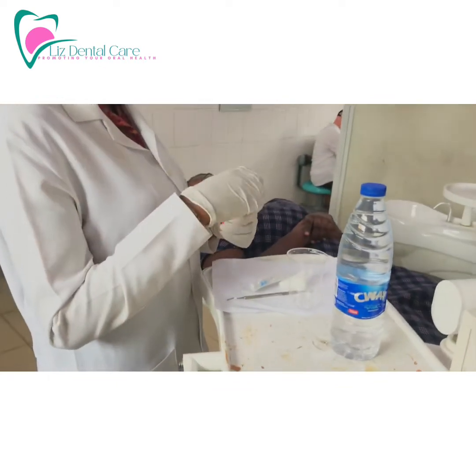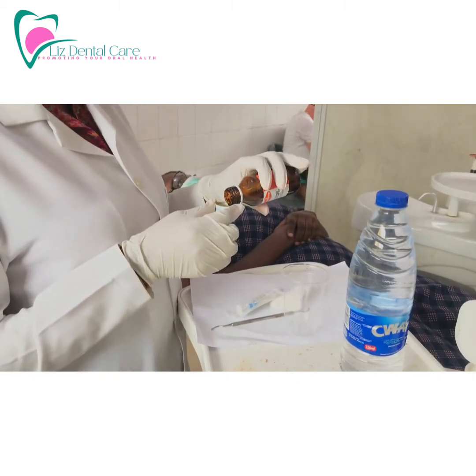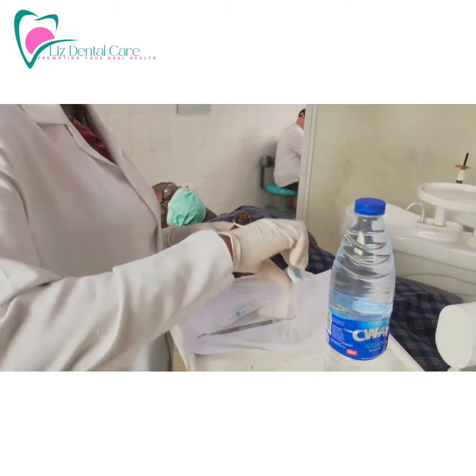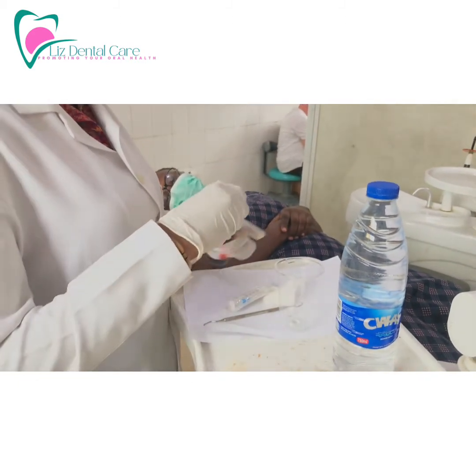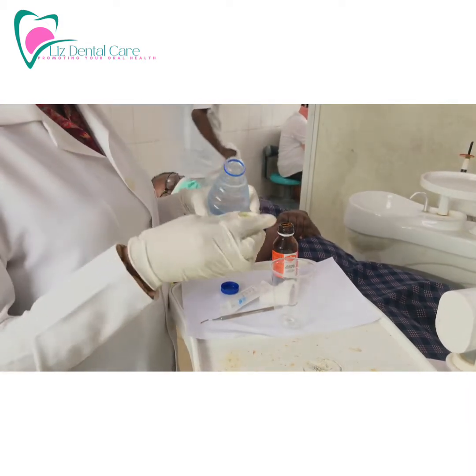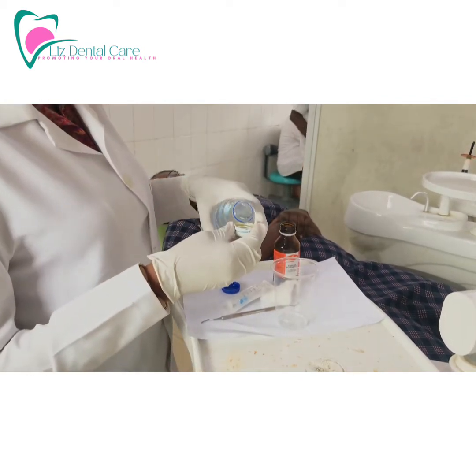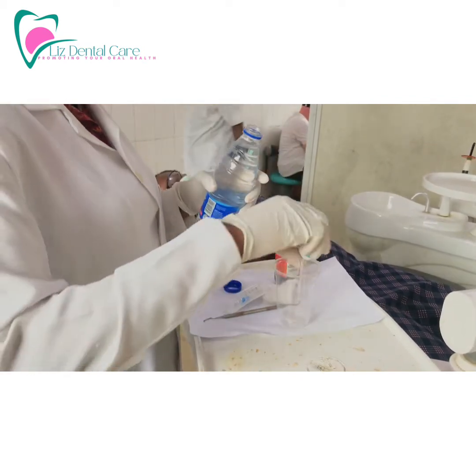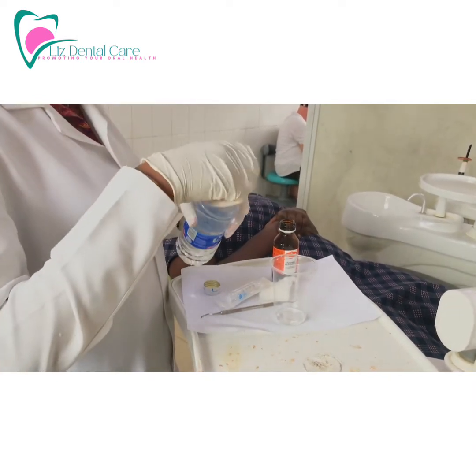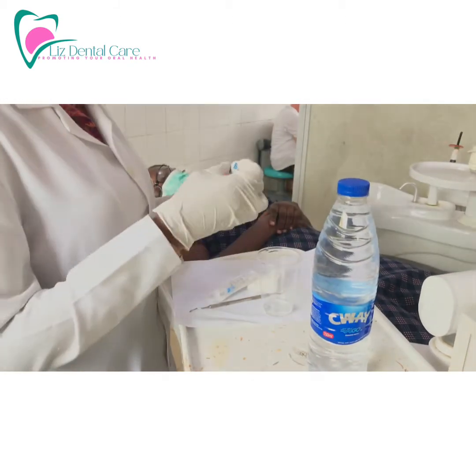Let's start mixing. Add one cup of hydrogen peroxide to the cup, then mix it with two cups of water to dilute the hydrogen peroxide. This will make the solution suitable for the procedure — the dental curettage deep scaling that you want to carry out.